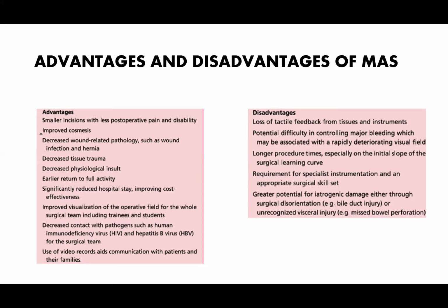And this is enhanced because of the magnification as well as advances that lead to recording and projection of these procedures we do. There are devices that are meant to record all these procedures, and they can be projected for trainees to follow.